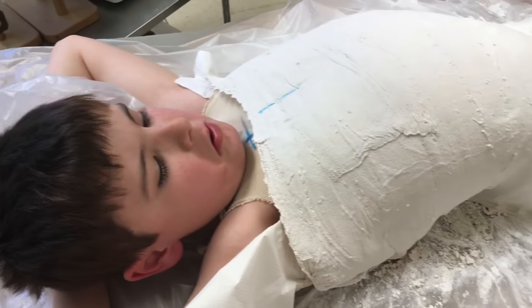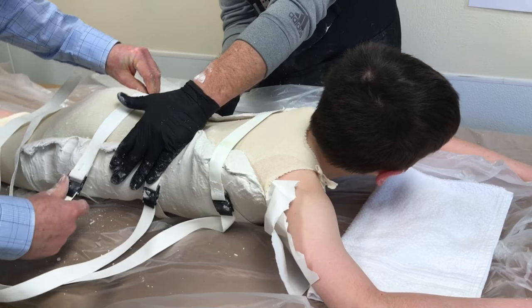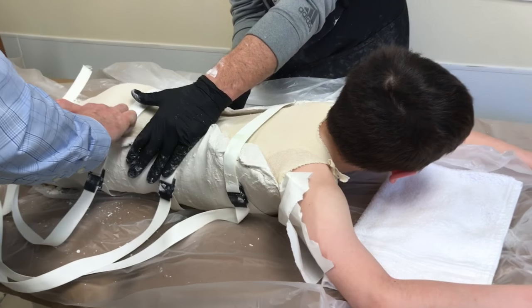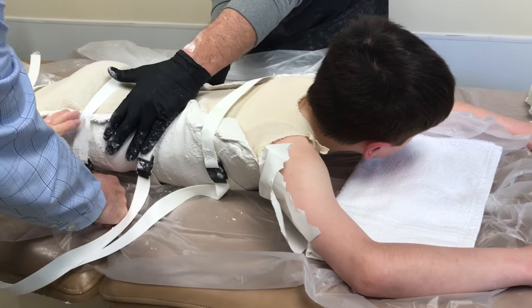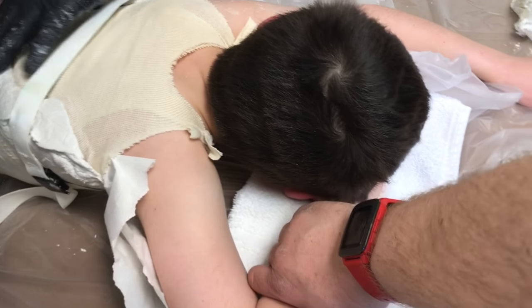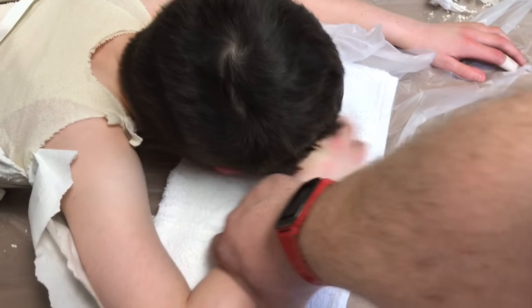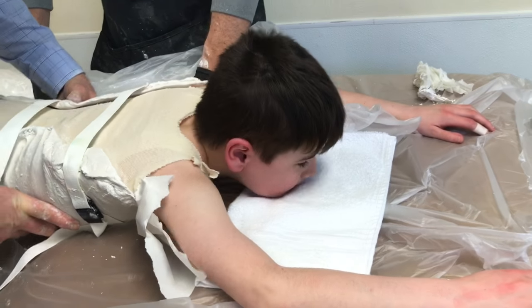Do you feel like a turtle? Just like right now on your hips, that's it — just until it's touching you. Okay, put your head down, bud. There we go. Now we're just thinking about your back here for a minute. I'm Cosmo! Look at the camera — I'm Cosmo. You're a robot now?